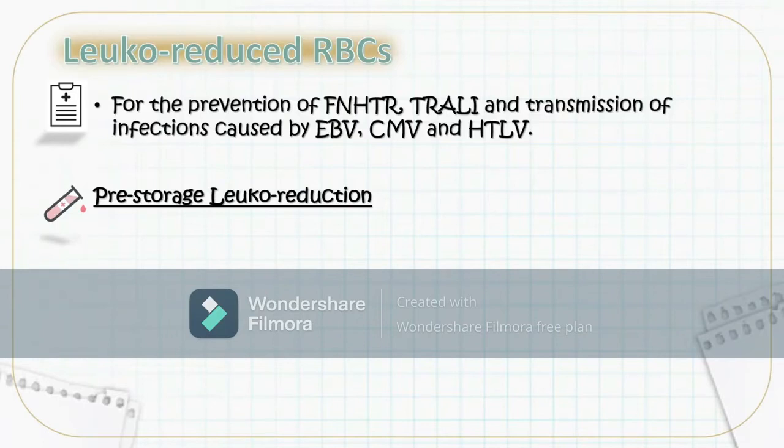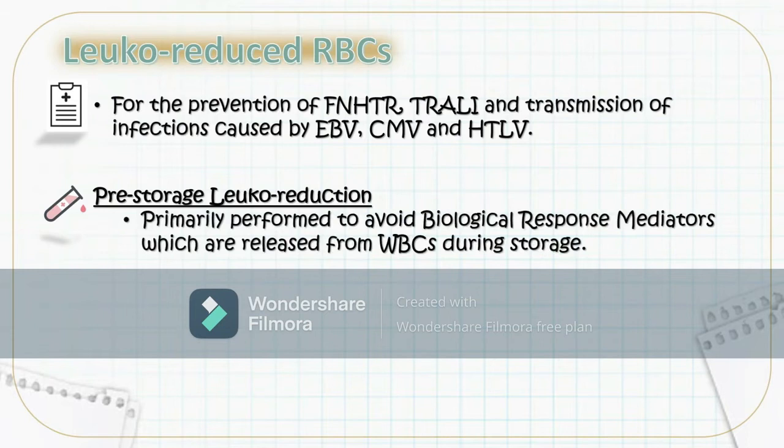the filter. So, pre-storage leukoreduction primarily targets the prevention of the release of biological response mediators which are released from WBCs when they are lysed during the storage period. And as what I have mentioned, these are the biological response mediators which are responsible for the occurrence of certain febrile reactions. Another technique is what we call your post-storage leukoreduction.